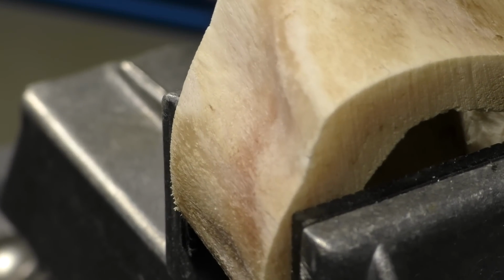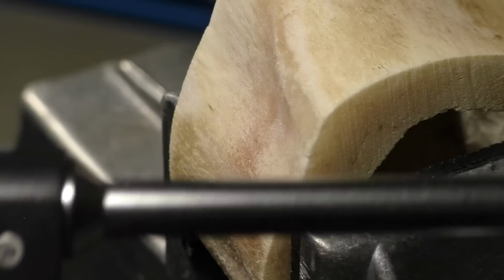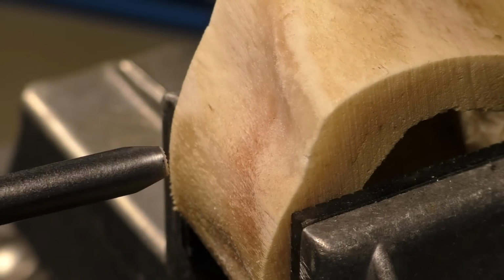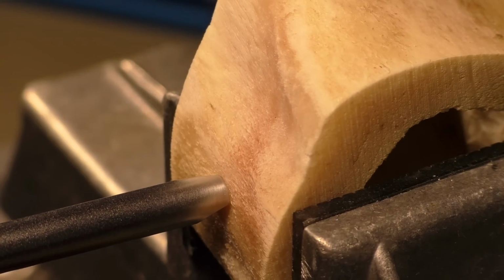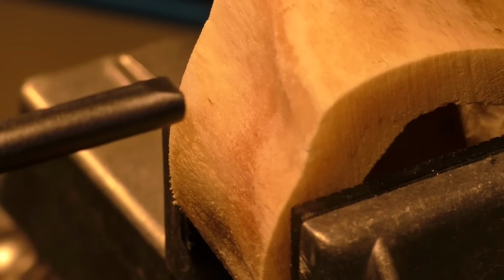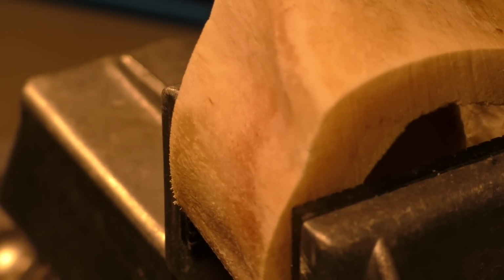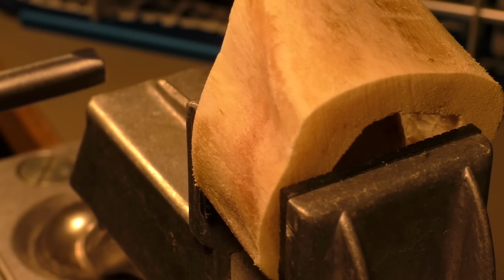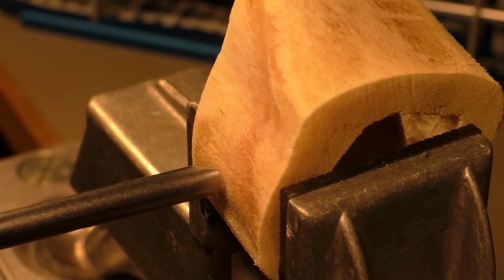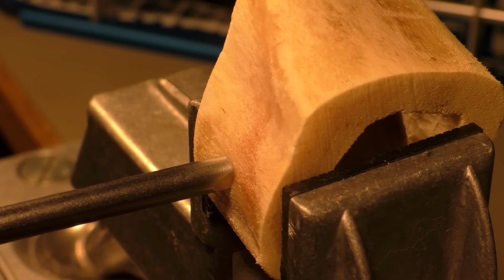So let's zoom into that. Okay, that's the drill bit guide, and I will try straight on here. I have to move that a bit. I get some funny colors here. The white balance is a little bit difficult on this zoom range. Okay, I think I can do that. So I hold this drill guide and I start drilling.